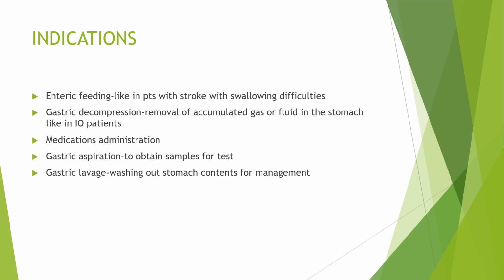in gastric aspiration to obtain samples for tests, for example when you want to do a test in TB patients who are still young, so in pediatrics, you can do this gastric aspiration and you do a GeneXpert for TB investigation.